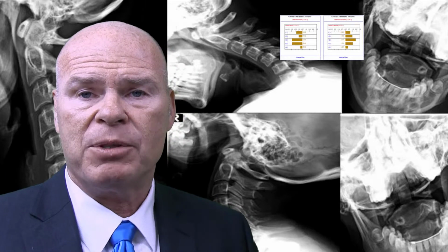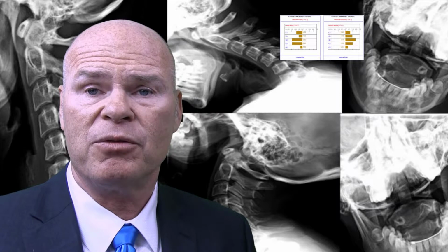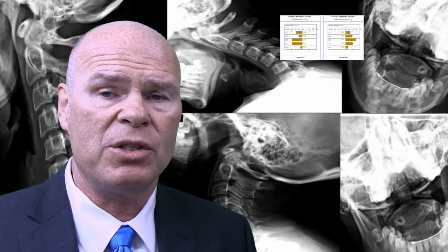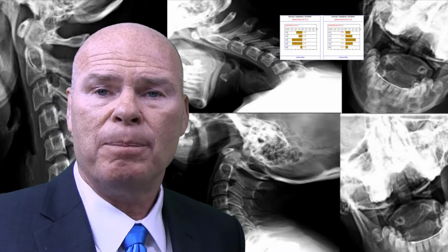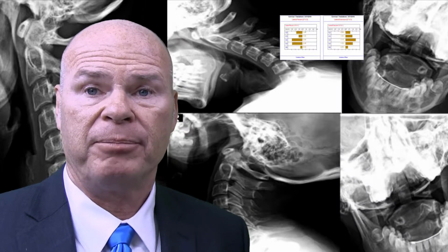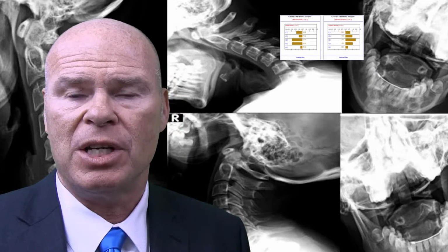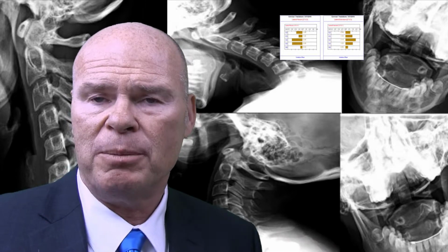So first 3 steps: subluxation assessment, spinal health assessment, including any assessment for spinal ligament damage, any soft tissue injury damage, any bony pathologies or fractures. You do a spinal instability assessment. Next, you assess for any bony pathology or any degenerative changes in the disc. That's step number 4. Step number 5 is you make an accurate count of the vertebra. And what is this done for? The ICA best practices says it's done so the doctor can determine the best, most appropriate treatment plan for the patient for that condition.